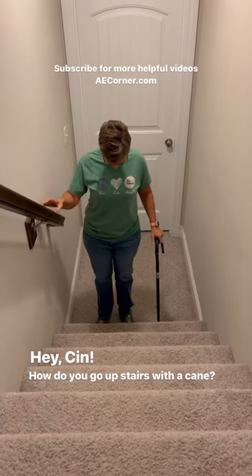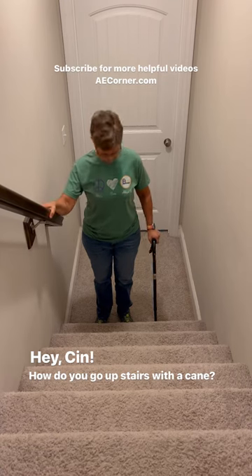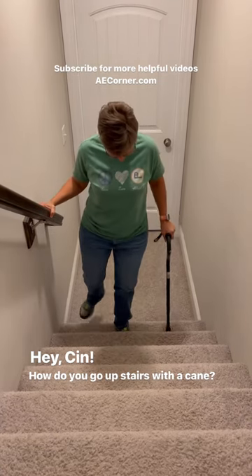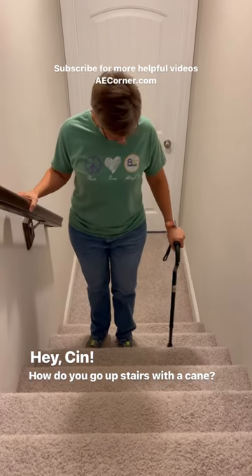So what you're going to do is come up. Let's say this is my bad leg right here, so we're going to step up with the good leg first. Up with the good leg, cane comes on up. Up with the good leg, cane comes on up.